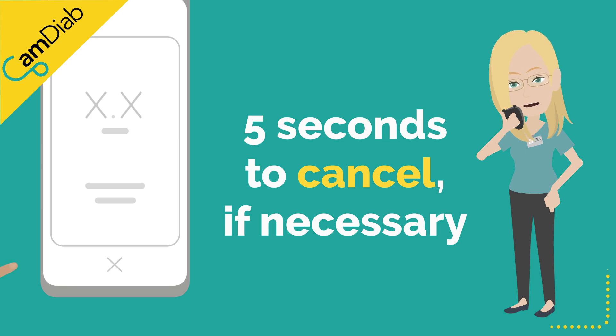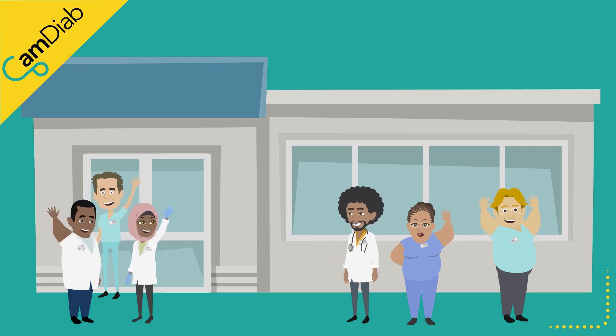You have 5 seconds to cancel the dose if you suddenly discover you have made a mistake. If you are regularly running high, please discuss any setting changes with your diabetes team.